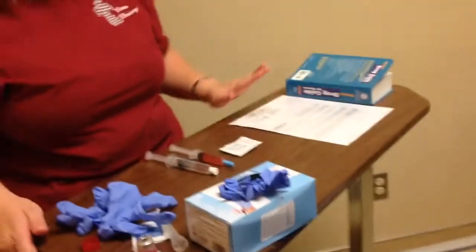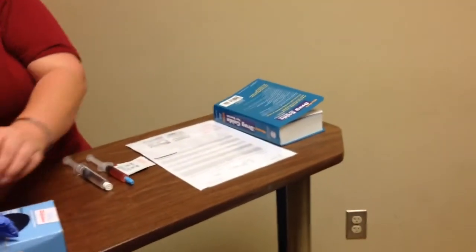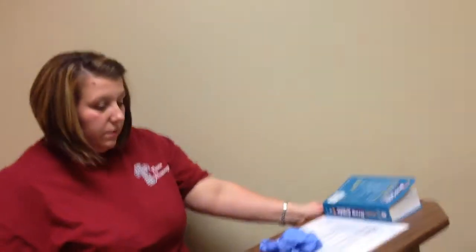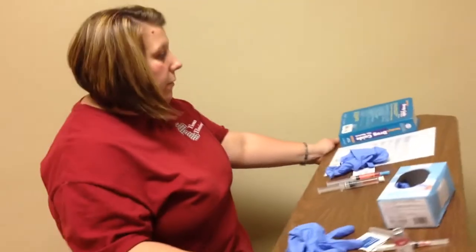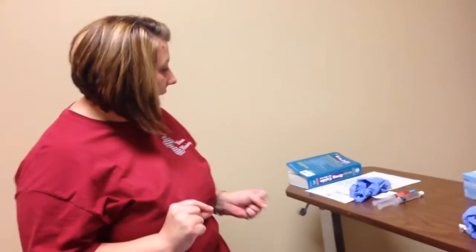I've got my MAR. I've got my medications. I have alcohol preps, and I've got another pair of gloves. Okay. Hello. My name is Tara. I'm going to be your nurse today. I heard you were in some pain. Well, I got you some medication.